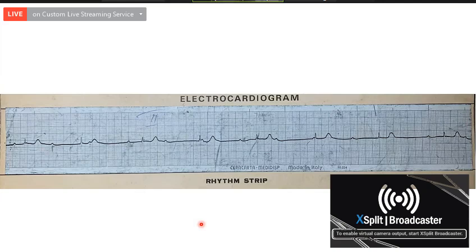What does the electrocardiogram show? Suprahisian complete heart block. Yeah, very good. So why did you diagnose suprahisian complete heart block, and how do you differentiate suprahisian from infrahisian complete heart block? QRS width is less than 120 milliseconds in suprahisian. If it's wide, it's infrahisian. Yes, very good. The broad QRS complex goes with infrahisian complete heart block, while suprahisian usually is associated with a narrow QRS complex. Okay, right? Yes.